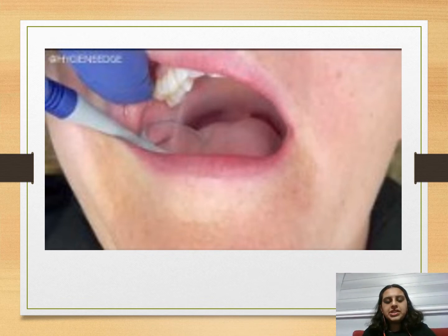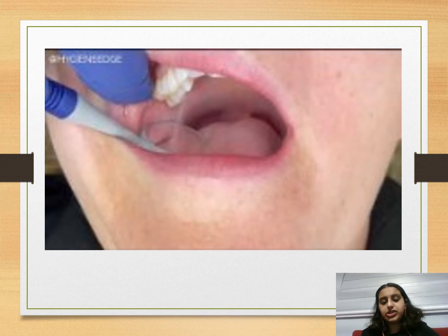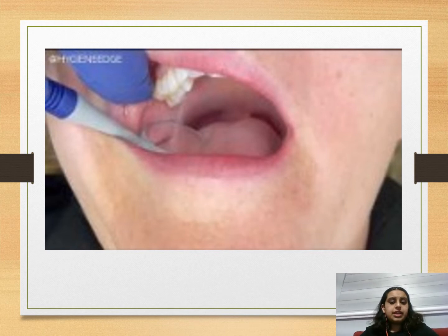So right now, she's just checking the saliva at the sublingual caruncle. Sometimes it just sprays out and actually goes on the patient's face and they don't even realize it. So now she's checking the parotid papilla as well, checking the saliva, to recap, checking the entry points for your saliva and seeing if it's free flowing or not. If it's not, then that's something to definitely note down. Maybe they're experiencing dry mouth, another risk factor for oral cancer, and dry mouth in that area increases cavities, things like that. Or it could be cancer in the gland, we're not sure, right?